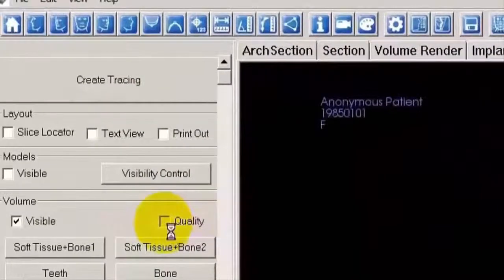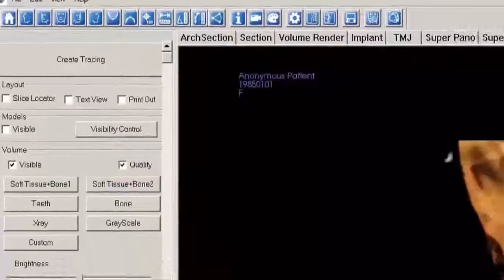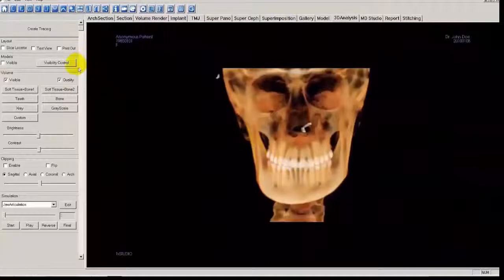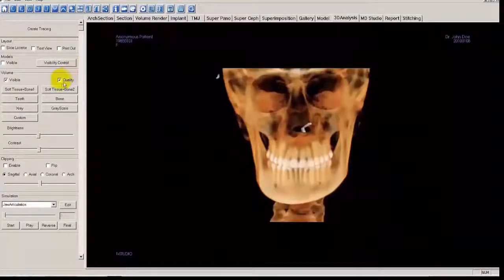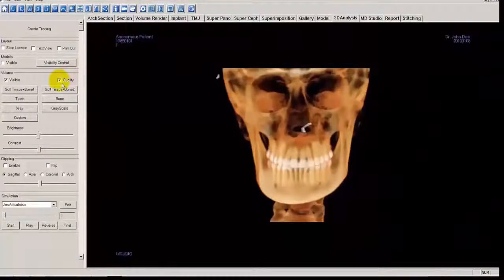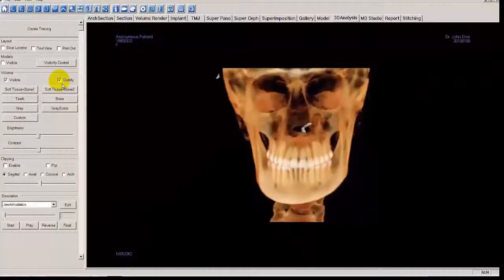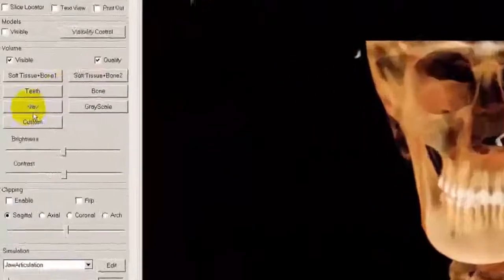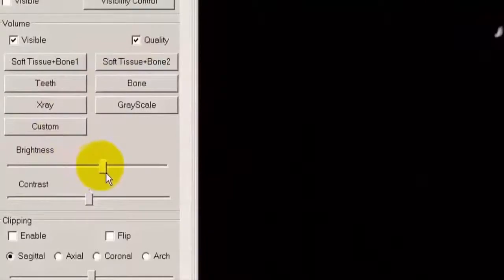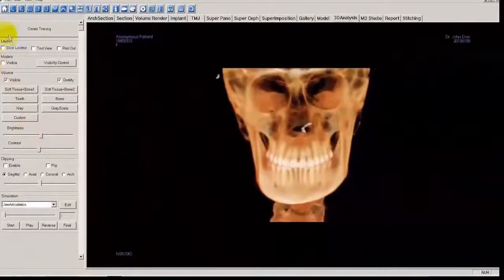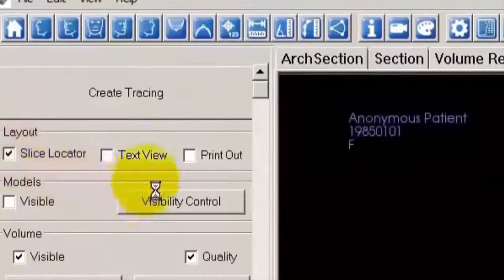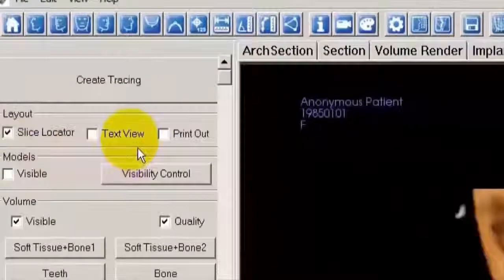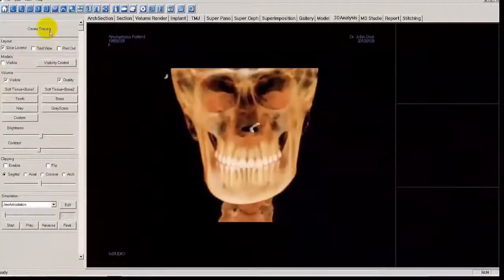Next, we want to select Quality. This will further enhance the quality of the image. If you have an older computer, you might want to leave that deselected — your software will function a little bit quicker. But if you do have a newer computer, go ahead and click Quality because the imaging will appear a little bit better. You can adjust the brightness and contrast as needed for better viewing. Select the Slice Locator, deselect the text view, and click Create Tracing.